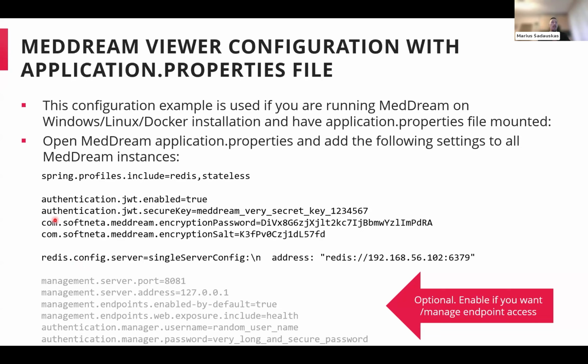So these are the mandatory settings to have Redis enabled in MedDream, and we also have this additional manage endpoint which you can open. You can include the health manage endpoint on which you can check the health status of MedDream.